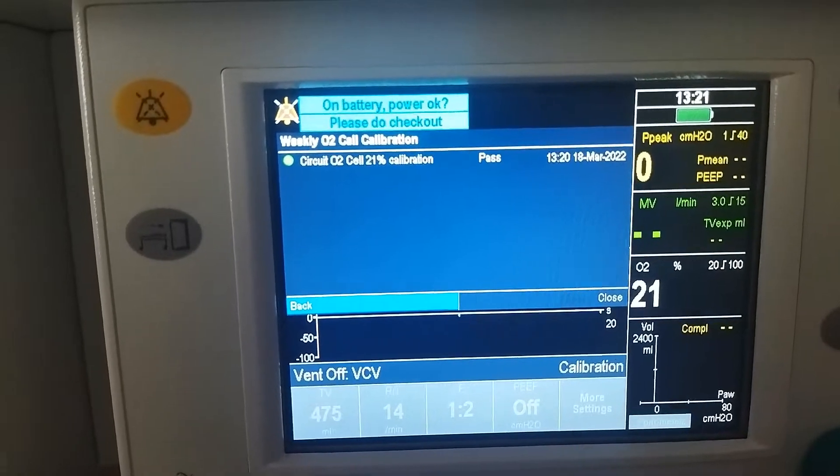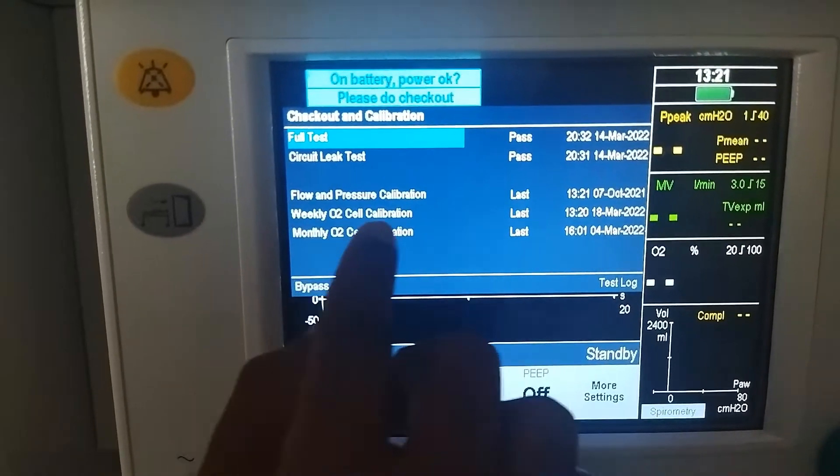You can go back. The O2 cell calibration is now complete.